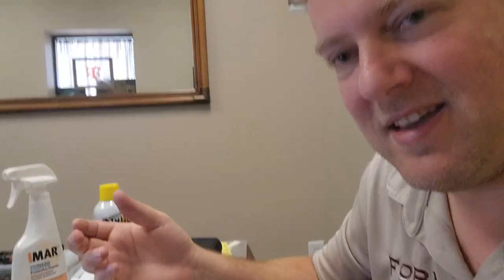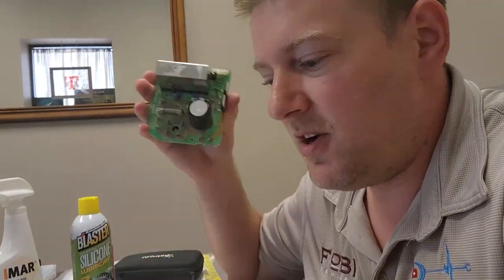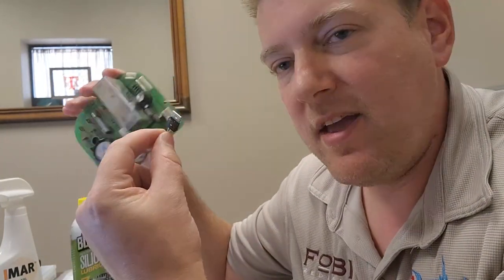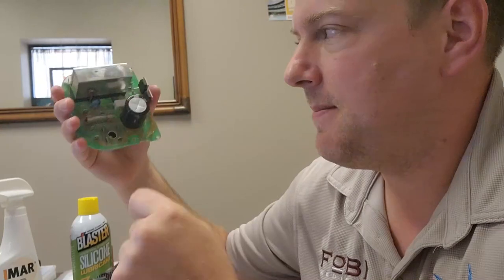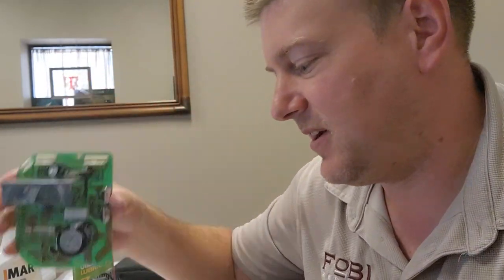But guys, there you have it. So this is a $175 board, and it's barely in stock anywhere. But this guy is less than $2, and you can find it at multiple sources. So that's what I'm gonna do. I'm gonna buy this guy, I'm gonna solder it in, and we're gonna test it out. Should be good to go. And that's why it always benefits you to learn electronics.